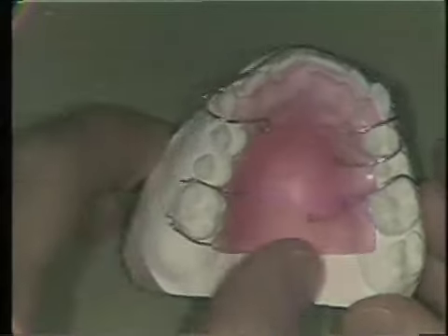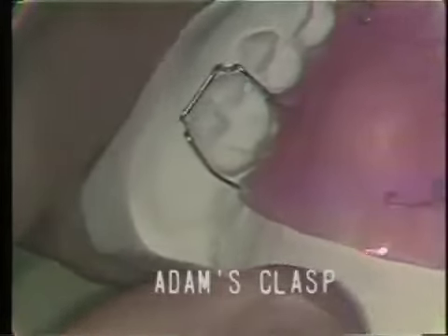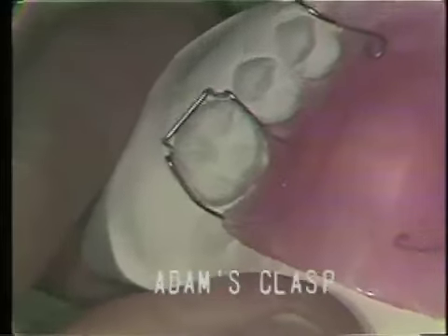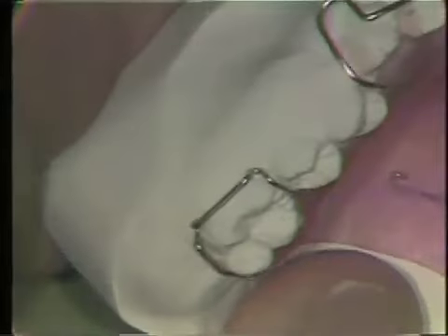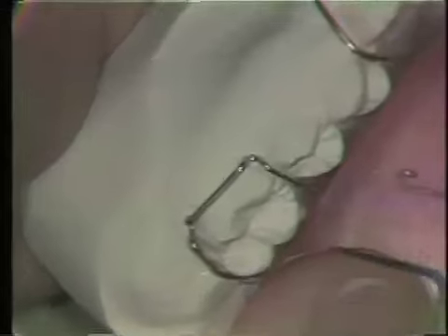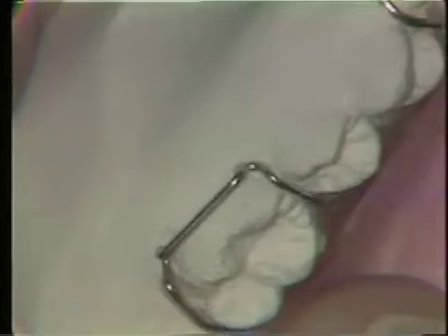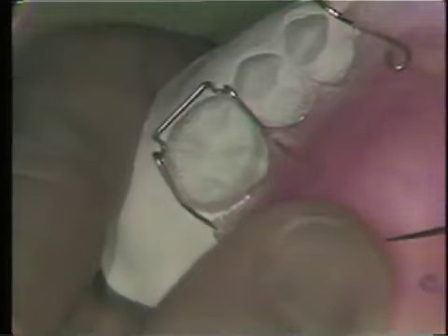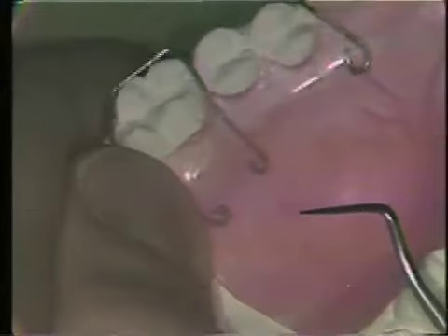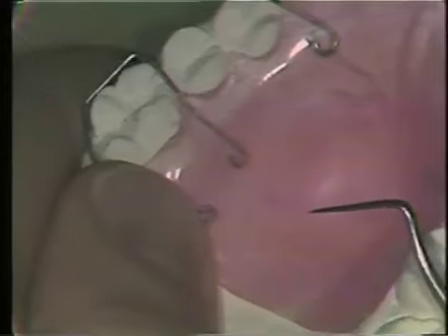One of the most commonly used clasps is the Adams clasp, named after the man who designed it, Dr. Adams. This clasp gains its retention from two small loops that engage the buccal proximal cervical aspect of the tooth. Usually there is an undercut area in this region of the buccal surface of a posterior tooth. The wire crosses the occlusal surface in the groove between the marginal ridges of the adjacent teeth, then sweeps down into the palatal area where it is embedded in acrylic.